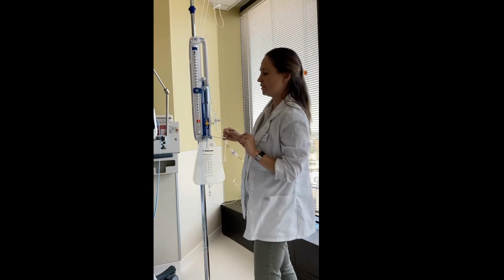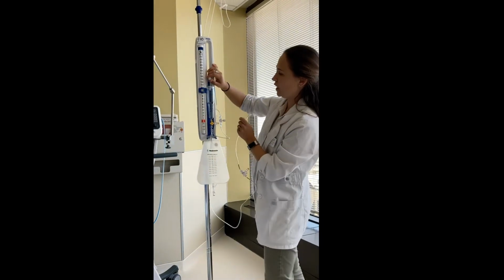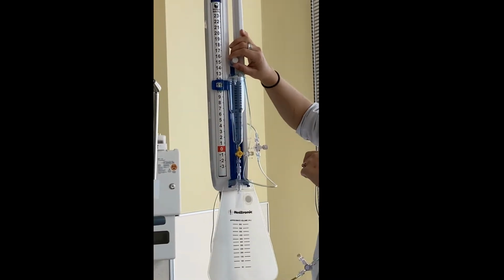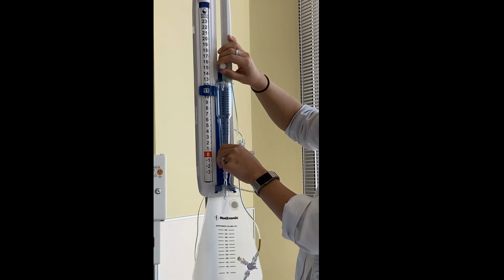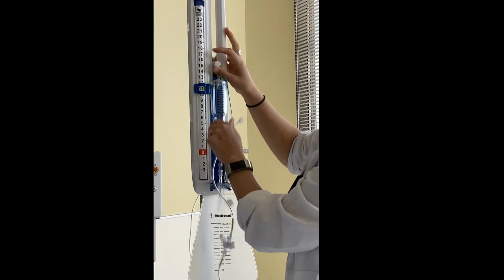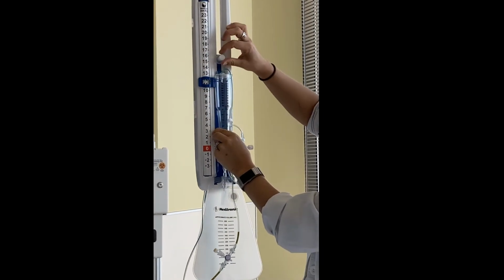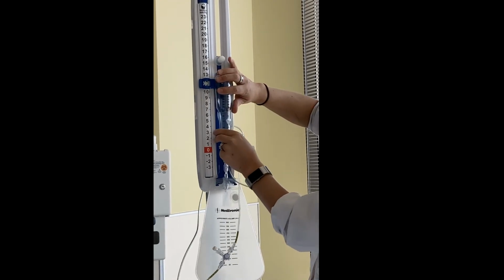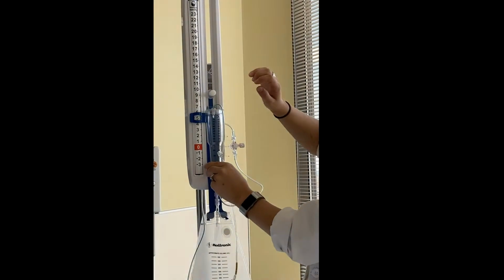So once I've connected my system, there are different settings that we can look at. Your burette or your drip chamber can be set at different levels depending on how much drainage your neurology team wants. So I can move this up and down. What's important is when you move it, you need to unscrew this little cap and you need to stabilize the collection chamber with your hands, because otherwise it's just going to drop.